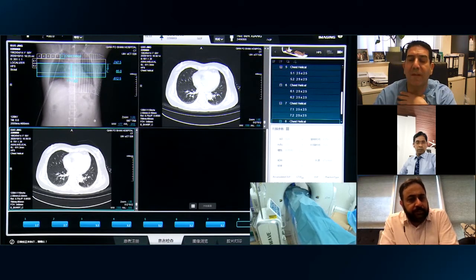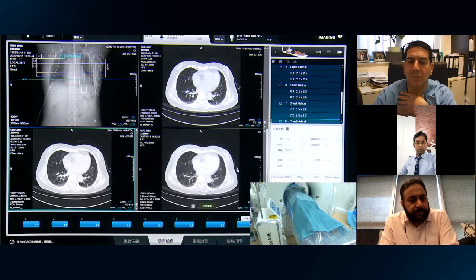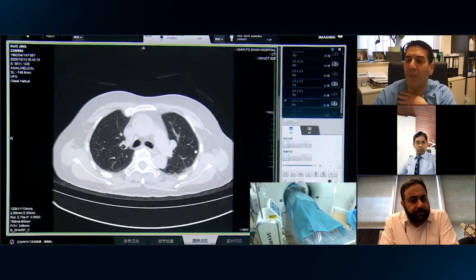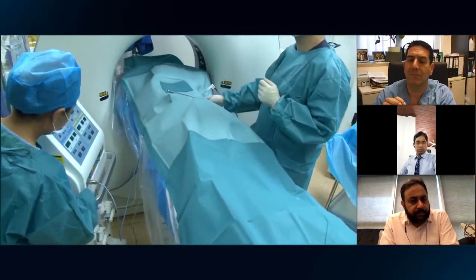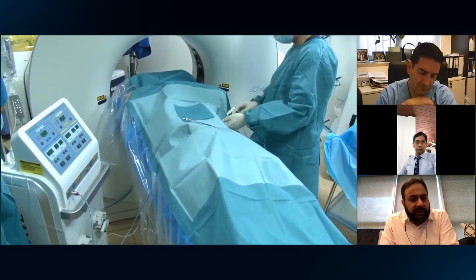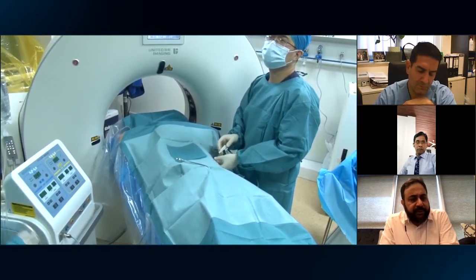And you do 50 watts for how many minutes? The ablation is still ongoing. The protocol says 50 watts for how many minutes in total? 3 to 4 minutes. Yeah. And that will give you an ablation zone in excess of 3 centimeters, most likely.